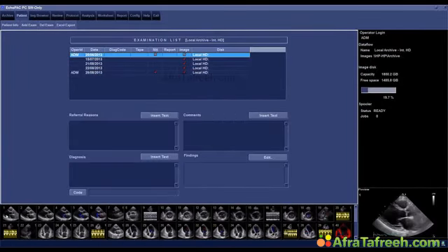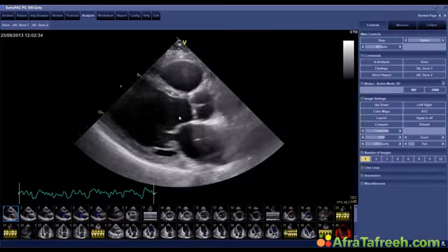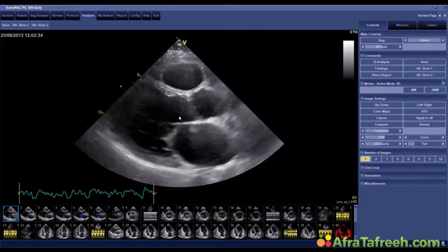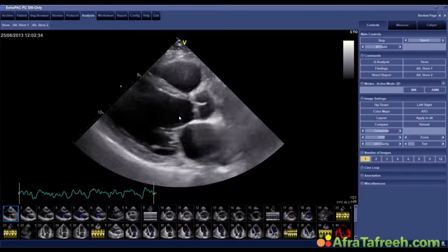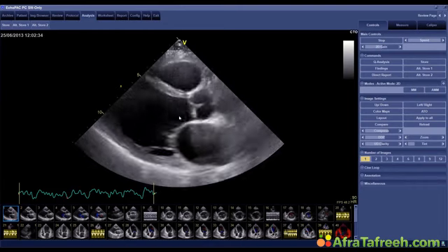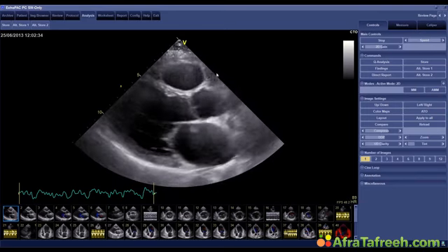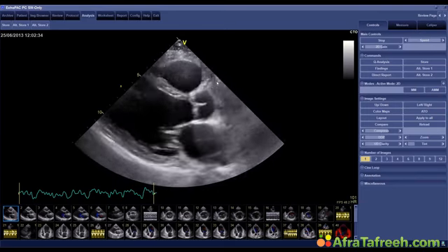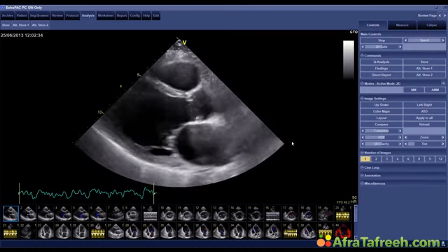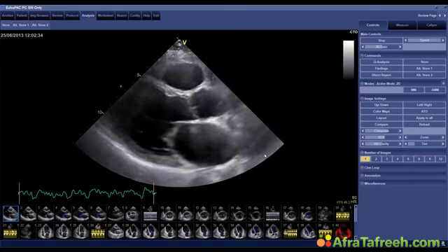So this is now the patient, and I think it will not be very difficult to see what his problem is when you see this parasternal long axis view. This is also something that should remind you that echocardiography is extremely powerful. All you need to do is put the transducer on the chest and you immediately get information which is so valuable. But aside from the fact that the patient obviously has poor left ventricular function, there's so much more information in this image, and that is what I'd like to show you in this case.